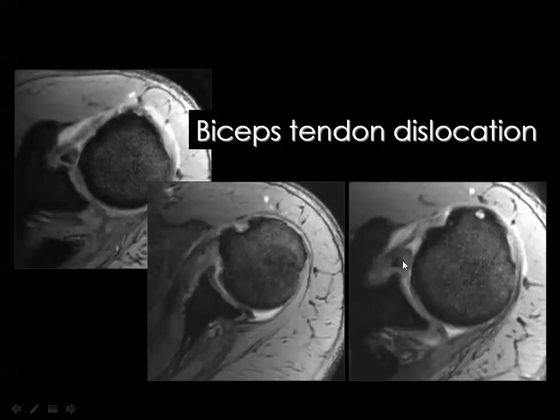You see here, this is the site of the biceps tendon. This is of course not the anterior labrum, because the anterior labrum is clear here, and this is the posterior labrum as well, you see here.